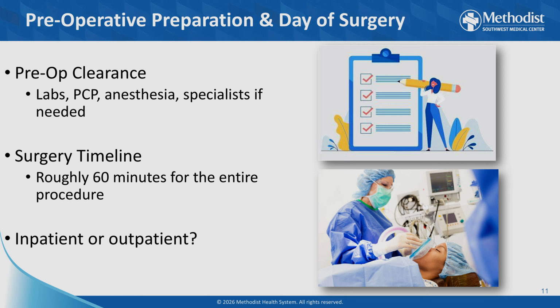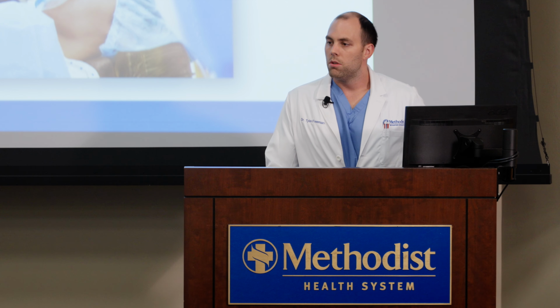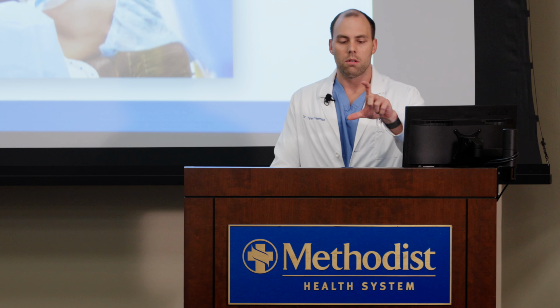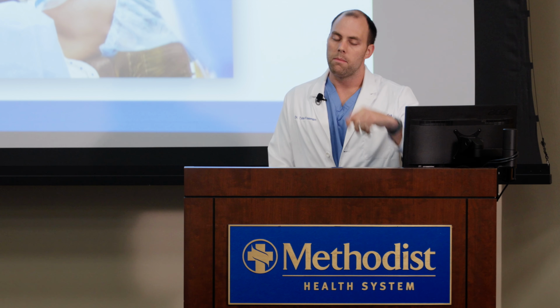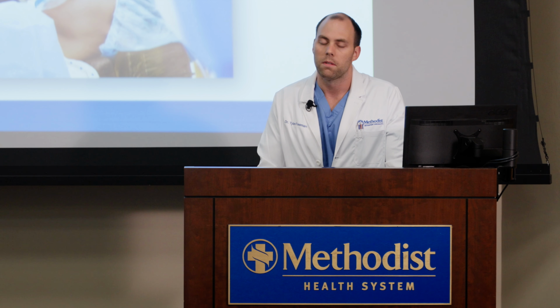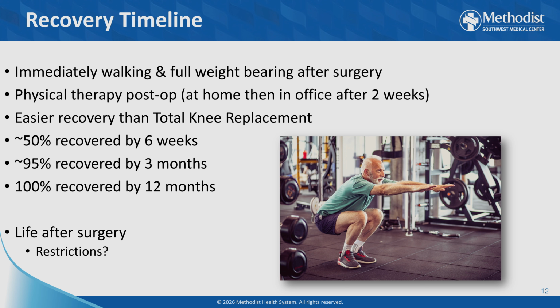Surgery itself, you come in the morning of surgery, you go totally to sleep. We give you a nerve block while you're asleep. I do a newer approach called an anterior hip replacement, where you get a small incision about this long on the front part of your hip. We go down in between the muscles. We don't cut through any muscles like the old way of doing hip replacements. And we perform the hip replacement. It takes about 60 minutes to do the entire hip replacement.